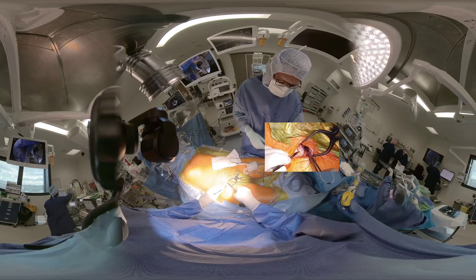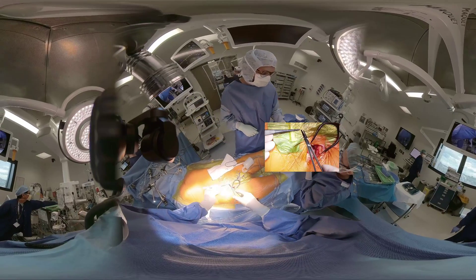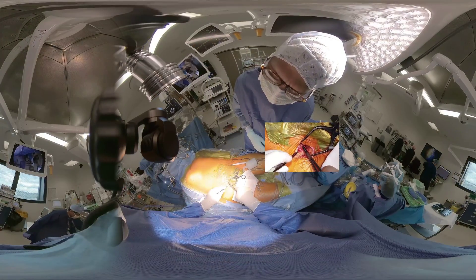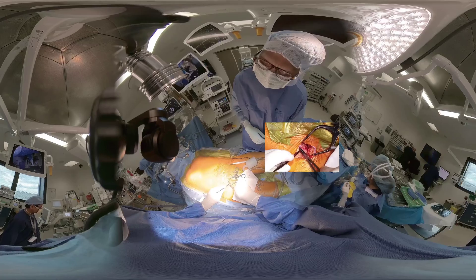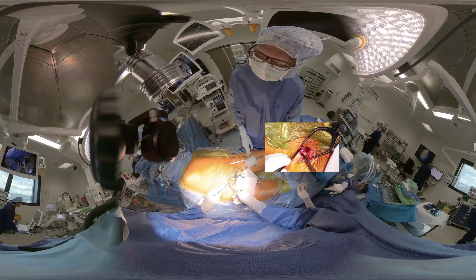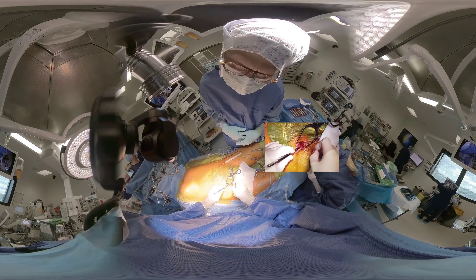Prolene-sutured purse strings are placed wide enough to lift a cap of vascular tissue after the cannulas are inserted. The cannulas are introduced using a guide wire, starting with the vein and then the artery.